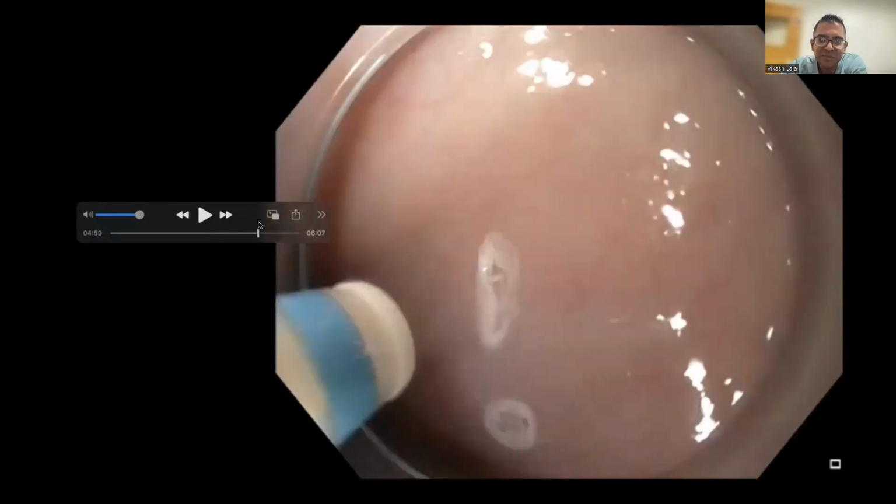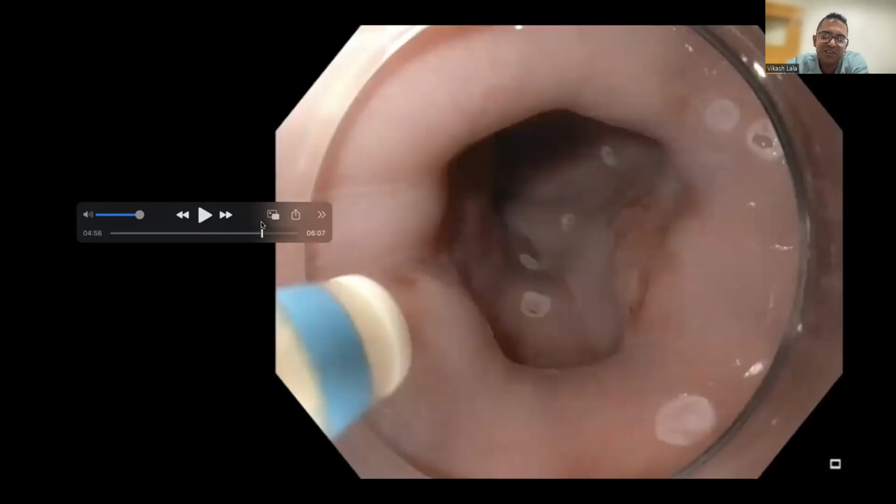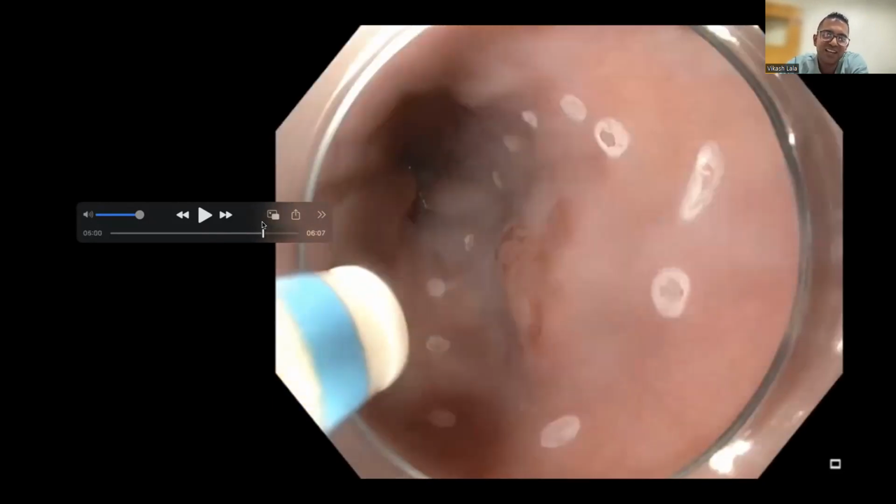But this was a bit tricky because how wide do you cut? You can't assess the vascular pattern. You can't assess the mucosal pattern. So I really had to just go nice and wide around that nodular or bulky area. And I really only had that to guide me. So this was a very difficult case.